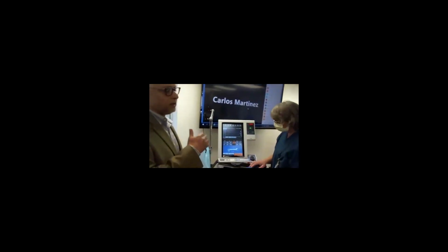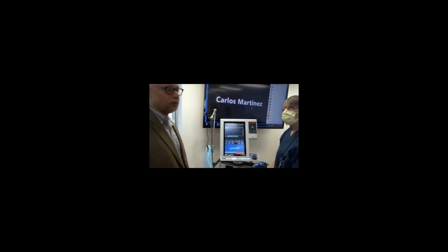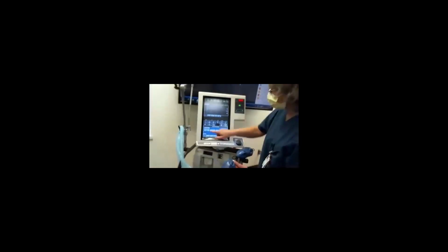We're using the pressure control. There's a bi-level too, another type, but I'm not going to go into that because it becomes more complicated. Then it becomes higher PEEP and lower PEEP and pressure support in each one of them. So let's concentrate on these two major ones, and most of the cases will be handled that way.